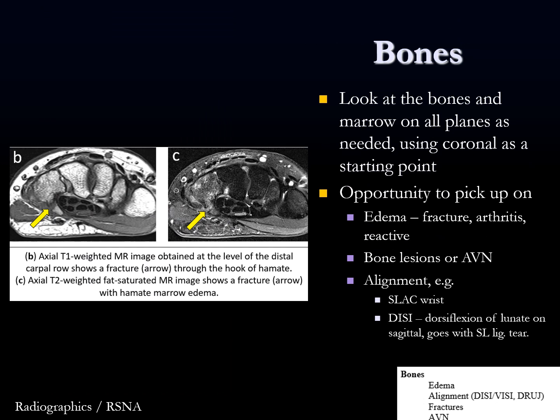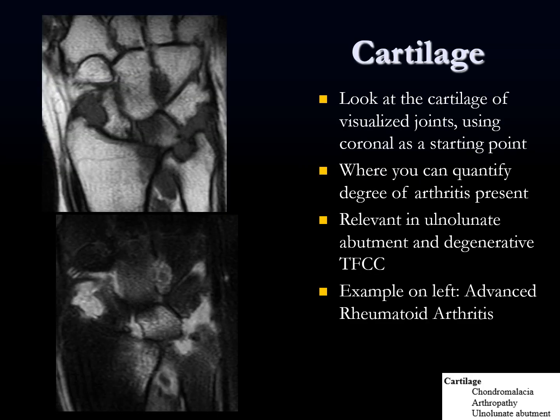Getting towards the end: bones — look at the bones and marrow in all planes, using coronals as starting points. Go through all the bones starting with the radius and ulna, work your way through the carpal bones, and into the metacarpals. Look for edema, fracture, arthritis, reactive edema. If you do find edema, try to find a reason — is there a fracture? Is this related to arthritis at the first CMC joint? Avascular necrosis could also be picked up at this point. This is also where I like to look for alignment issues — SLAC wrist comes from disruption of the scapholunate ligament, proximal migration of the capitate, and arthritis at specific points. DISI refers to dorsiflexion of the lunate on the sagittal and goes with scapholunate ligament tear.